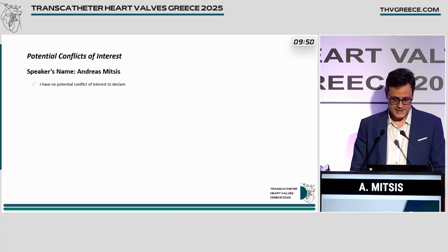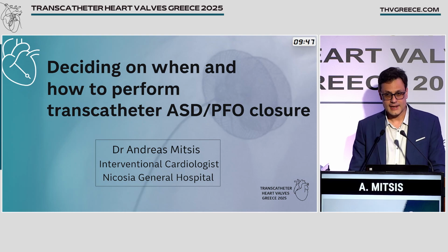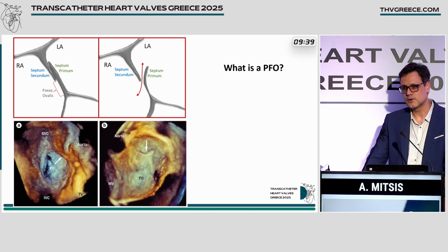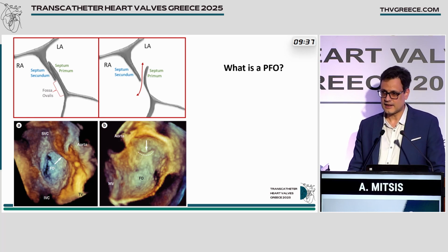And in the next 10 minutes, we will discuss when and how to perform transcatheter ASD and PFO closure. So what is a PFO? PFO is a persistent communication between the right and the left atrium.